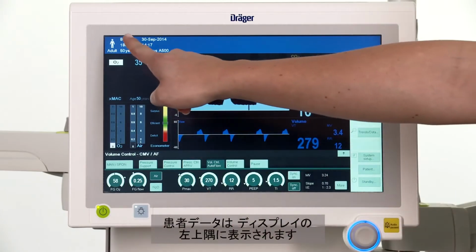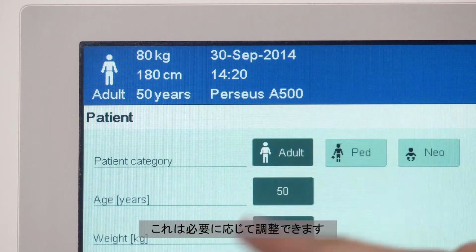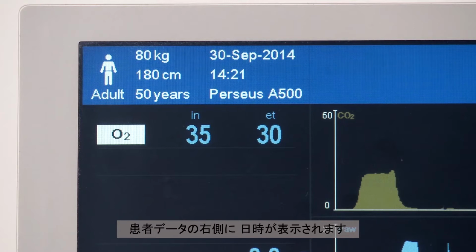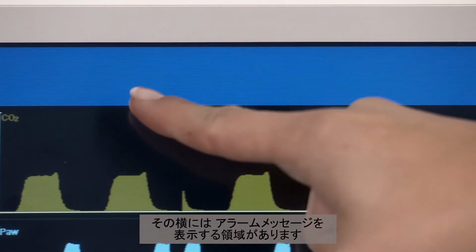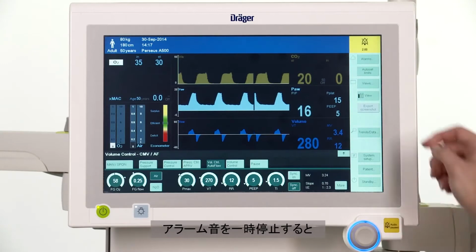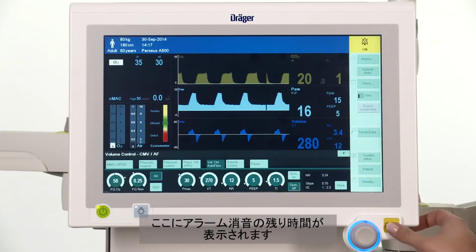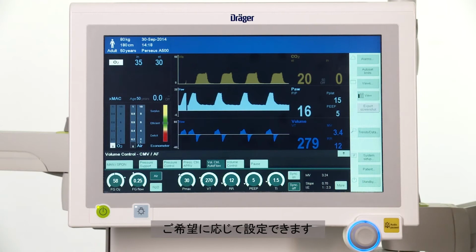The patient data can be found in the upper left-hand corner of the display. These can be adjusted if necessary. To the right of the patient data, you will find the date and time. Next to that is an area for displaying alarm messages. If you have paused the audible alarm, this is where the system will indicate the residual time that the alarm remains muted. You can configure large sections of the screen of the Perseus according to your individual requirements.